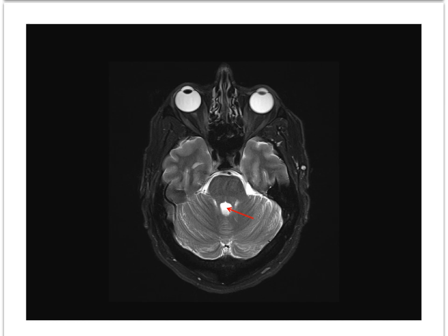Moving further cephalad, we can see the rostral portion of the 4th ventricle. Its lateral margins are the superior cerebellar peduncles. Here is the posterior lobe of the cerebellar hemisphere and the anterior lobe. The primary fissure of the cerebellum that separates anterior and posterior lobes was better demonstrated on the sagittal.